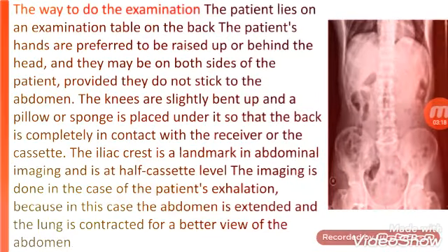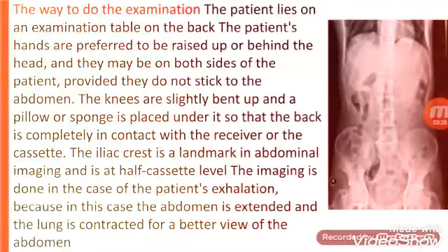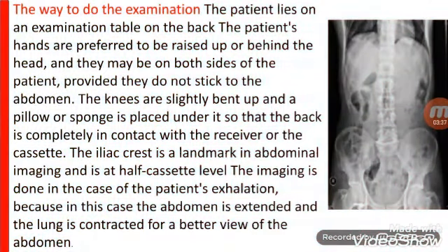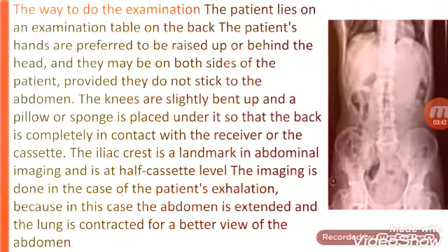The iliac crest is a landmark in abdominal imaging and it is at the half cassette level. The imaging is done in the case of patient exhalation, because in this case the abdomen is extended and the lung is contracted, for a better view of the abdomen.